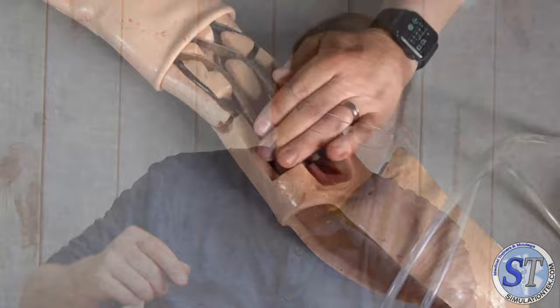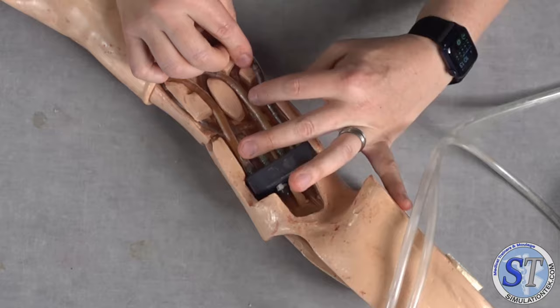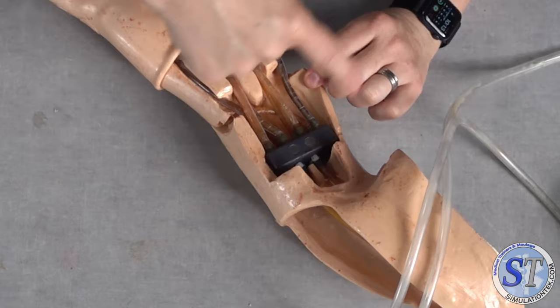As you can see, there are definite things that have been growing in here, and there are a lot of different pathways that these tubes go into. Take pictures. If you have an IV arm that's this complicated, unlike my Laerdal ones, which are pretty much a standard pathway, this one is very complicated. It's got a lot of different pathways, a lot of places that you can cannulate, but I recommend you take some good pictures so you know how it goes.